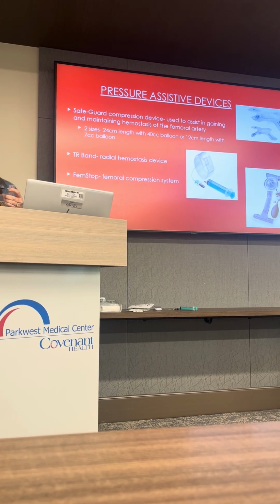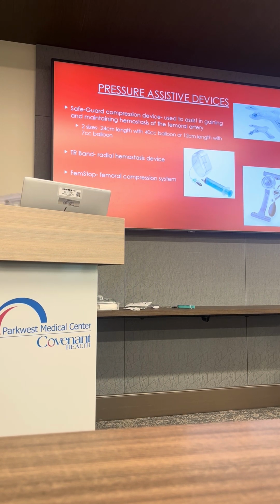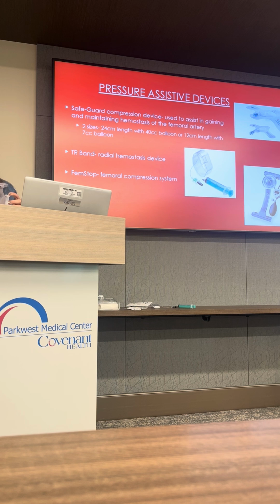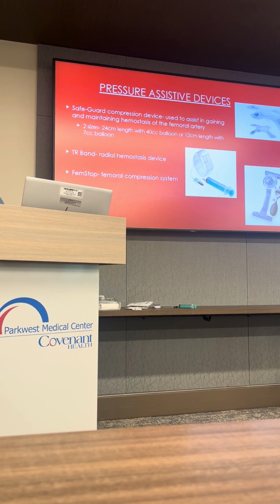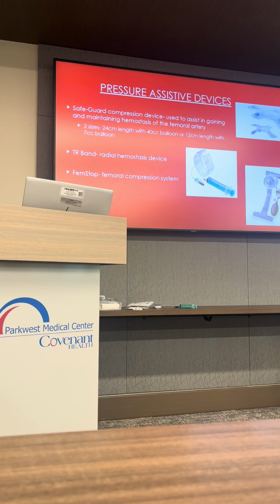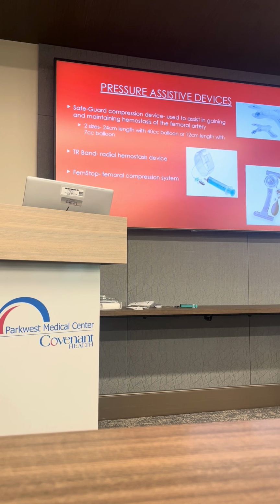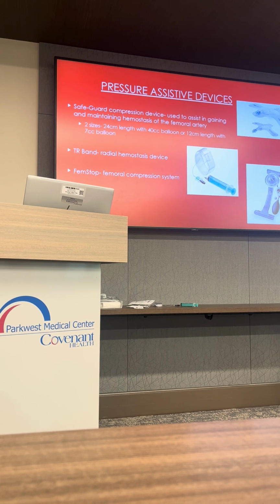If you're not familiar with the device, it's best for you to get familiar before you need it. So I definitely encourage you to come up here and look at it. I'm obviously going to give it back to Laura and she can take it back to the unit. So if you know other people who maybe haven't had a chance to use a FemStop, it's better to use it now than in an emergent situation. Again, it too has a device cover on the back. It's a plastic piece. This isn't meant to actually go on the patient. It peels off, and then you'll be able to feel the soft silicone pressure device that actually has air that gets pumped into it for us to be able to hold pressure.